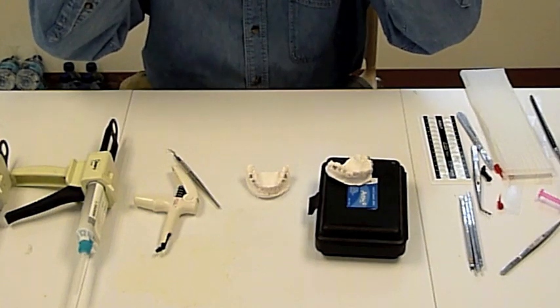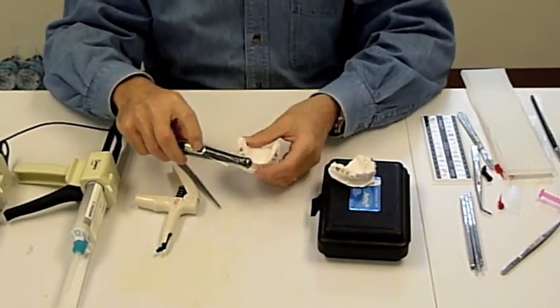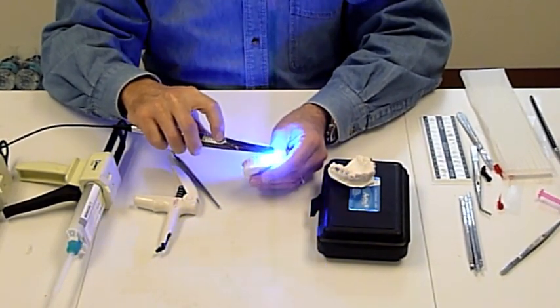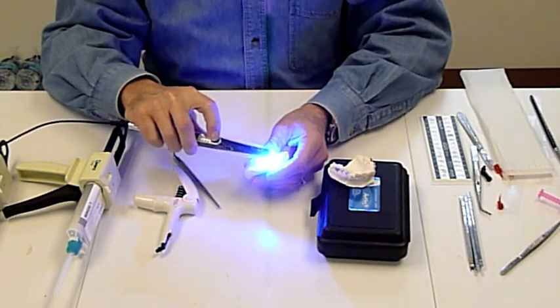I recommend that you wear glasses when you use the Velo lights to protect your eyes, and then we will go around and cure each of the tubes and brackets.